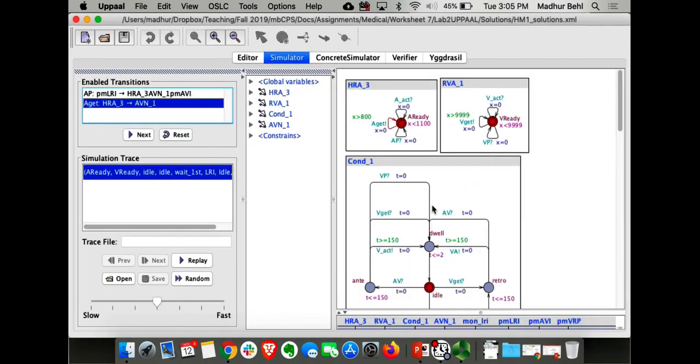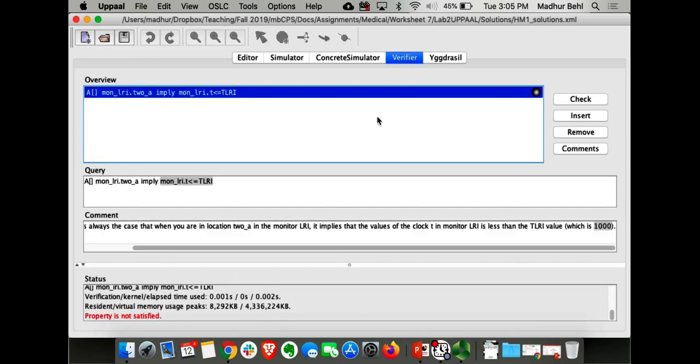And what we expect now is that with this heart, which is in bradycardia, which should not satisfy the property, does the pacemaker ensure that that property is satisfied? That's the job of the pacemaker. If you are in bradycardia, it's trying to fix that by maintaining the LRI.